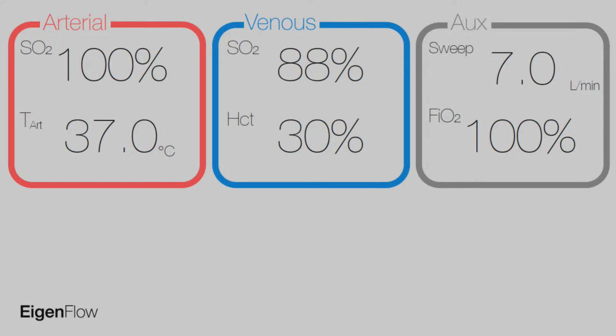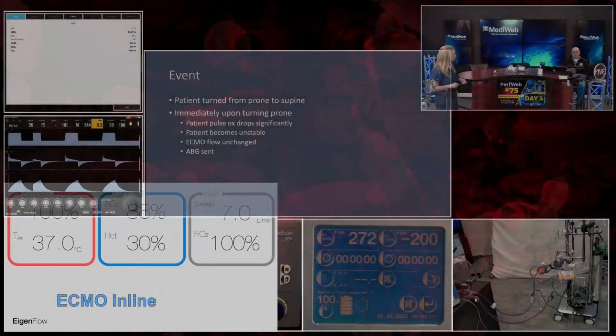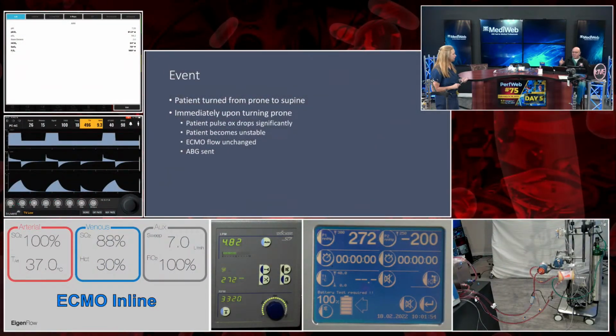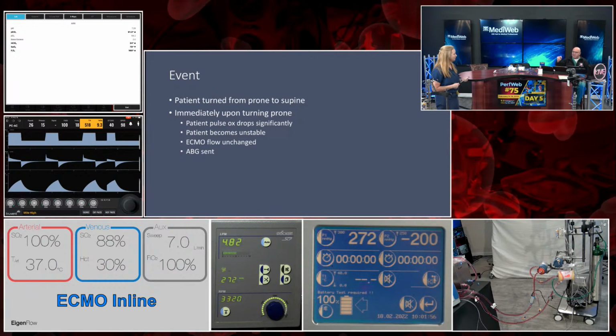It was 70. Yeah, so our venous sats went up. Way up. What does that tell us? That the vent change impacted. No, that's the inline. Oh, the inline. SVO2. So the patient is not extracting as much O2? No. Okay. How about there's a lot of recirculation potentially? Ah, yes, recirculation. Because there are different ways you can infer recirculation.